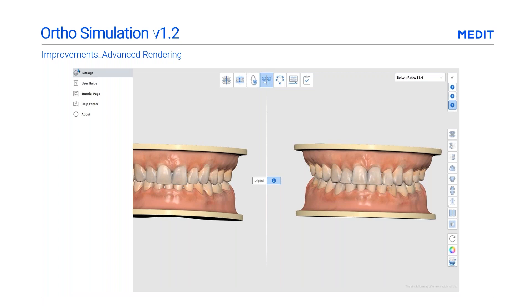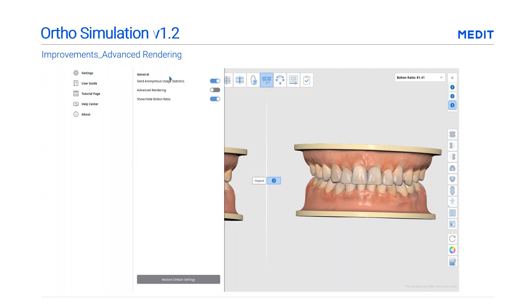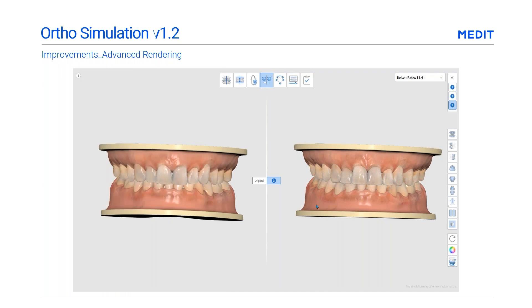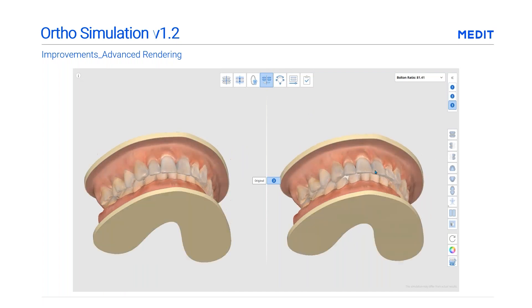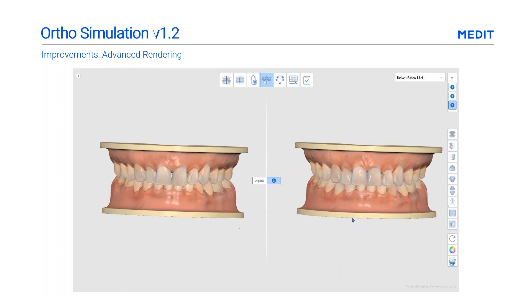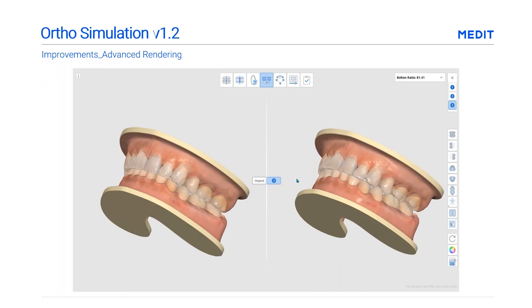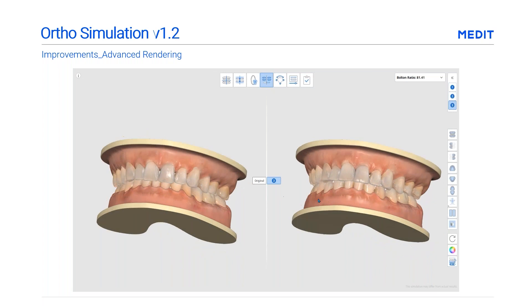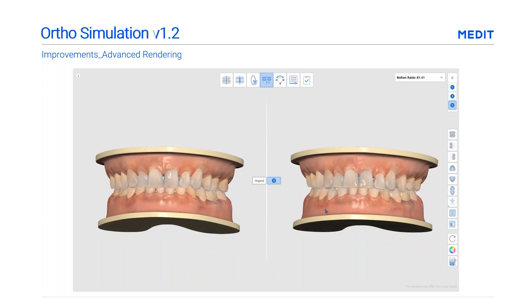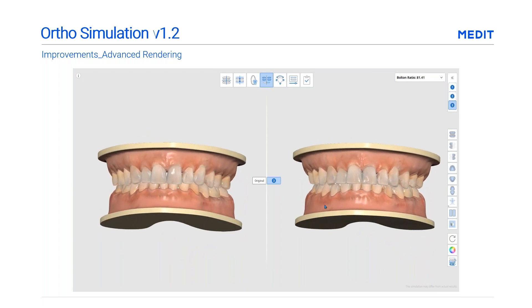Medit has also added an option that provides a more vivid rendering of scan data. Turn this option on and off by going to Settings, General, Viewing Options, Advanced, and then Rendering, as shown here.